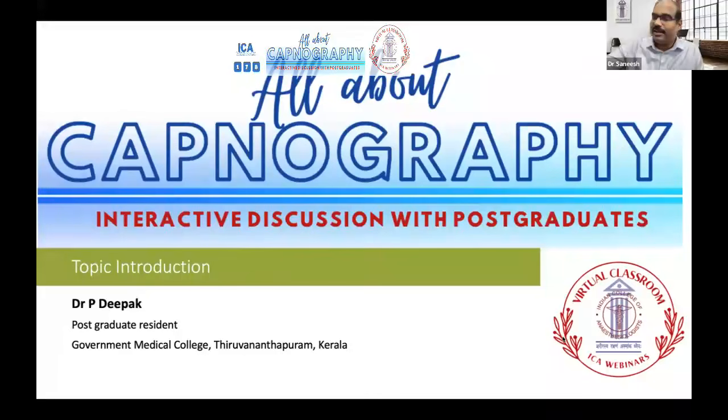Already there is a query regarding EtCO2, whether it is reliable in one lung ventilation thoracotomy. Basically, this is a non-invasive measure which is very close to the arterial partial pressure of carbon dioxide, PaCO2. It's already mentioned that normal EtCO2 to PaCO2 differences are going to be 2 to 5, but it all depends on the sampling.